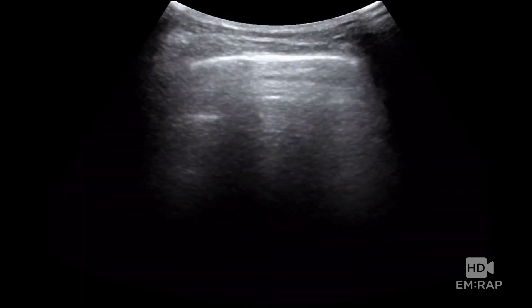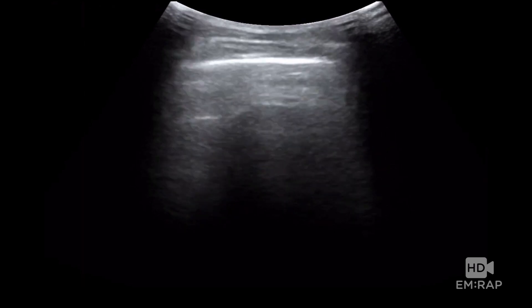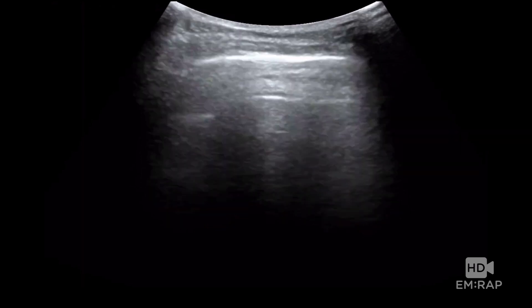Here's an example of an area of the lung without pulmonary edema. So imagine a rib-rib shadow, rib-rib shadow. This is the pleural line right here, and this guy right here, this horizontal artifact is called an A-line. A stands for air. It means not pulmonary edema.